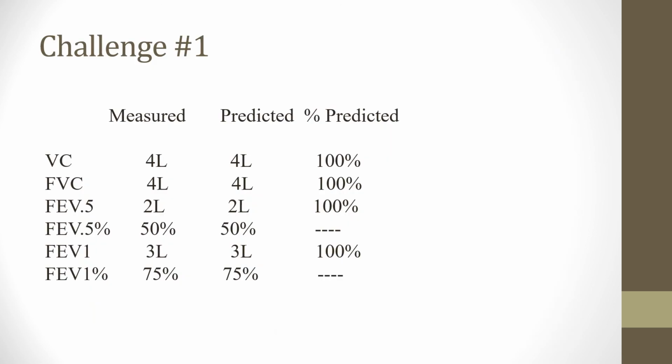All right, so these slides are just, hey, let's look at how to look at an ABG, or not ABG. Let's approach this like we did our ABGs, where we put our labeling on them so we can tell if this is an obstructive, restrictive, or both pulmonary function test. So obstructive, restrictive, or combined results. So when we're looking at this, I want to label my volumes and my flow rates.